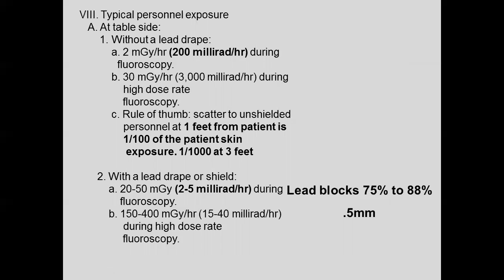And what we've decided, I don't have this article, there was a cost-benefit analysis of how much you should spend to reduce radiation by how much, okay? In a typical cath, the golden cath rule at the VA is we want to get our fluoro time under 2 minutes.